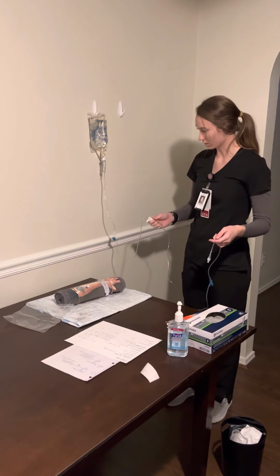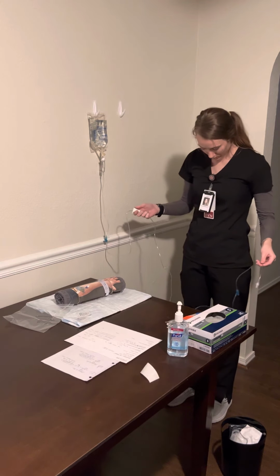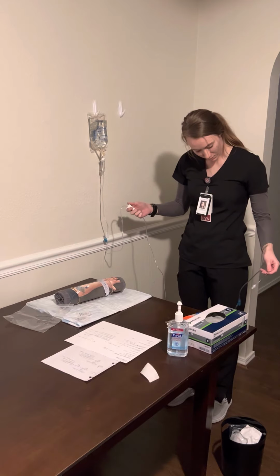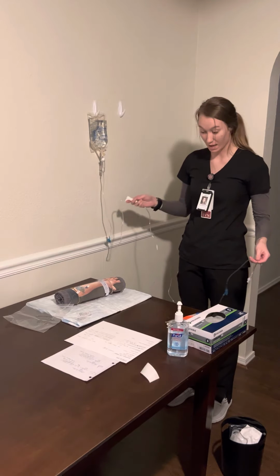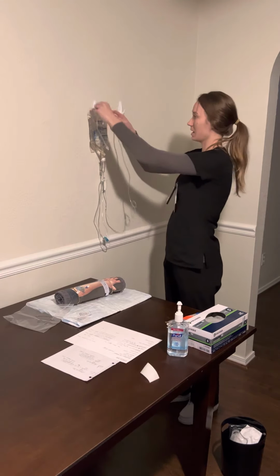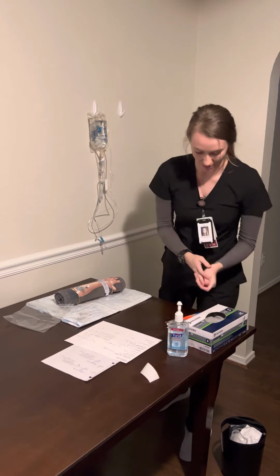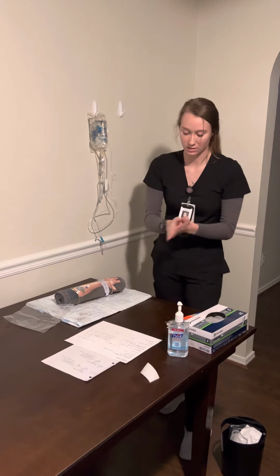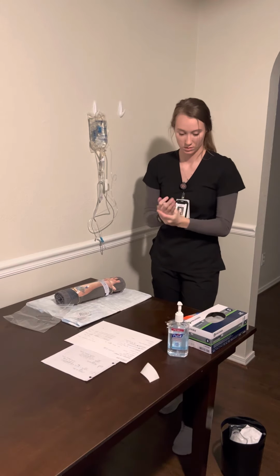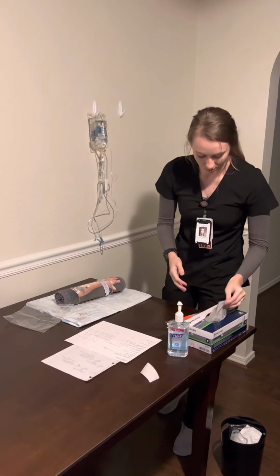And then I'm going to prime the tubing to ensure there's no air in the line. So we'll open that roller clamp. All right, so that is primed. There's no air in my line. I'm going to keep the cap on the end of that tubing and assess my IV site. So I'm going to wash my hands. I'm going to don clean gloves.